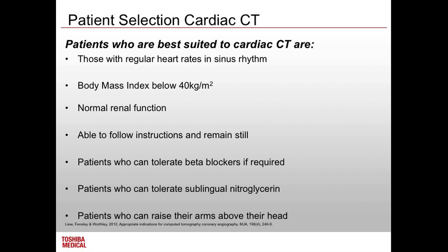Patients who can tolerate beta blockers. Everyone talks about, oh, we can scan without beta blockers. Yeah, everyone can scan without beta blockers, but nobody does because it'd just be silly. You'd increase the dose to your patient for the sake of a $10 pill that's really safe. So everyone beta blocks. Then sublingual nitroglycerin, that's just the GTN spray, the same stuff that you get if someone's having chest pain in an emergency department. Lift your tongue, spray it under there, and it dilates your blood vessels.